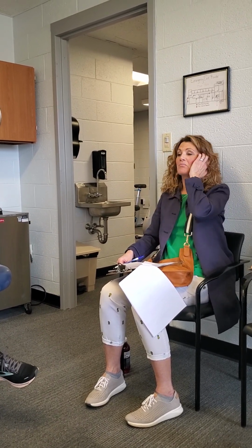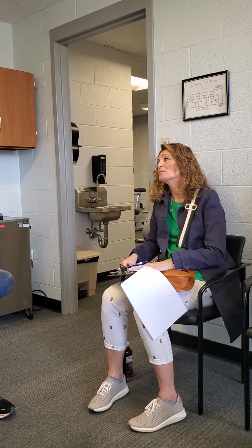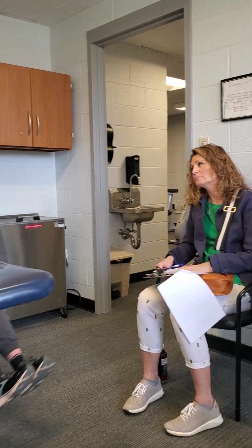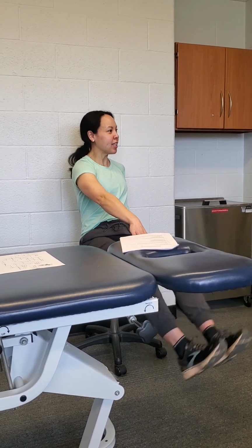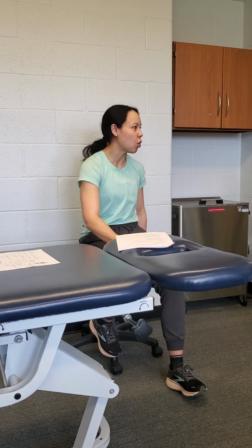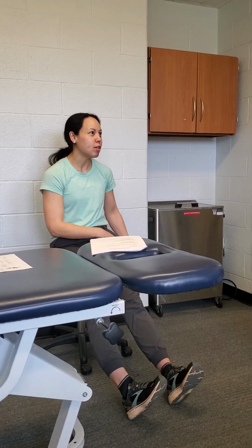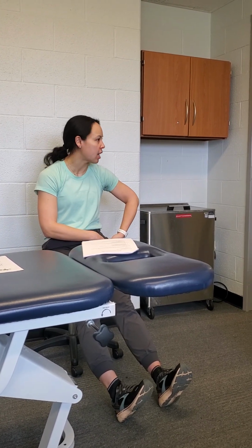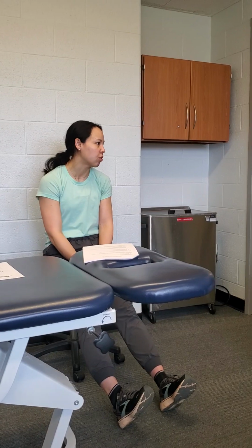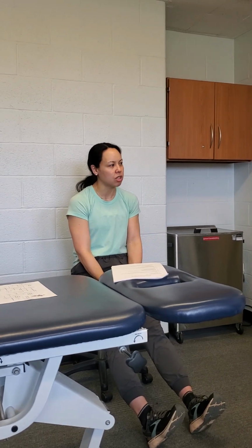Right, correct. So even if you're doing it on the side that's weaker, it will have a crossover effect on the other side. And in that study, they just did bilateral knee extensions 3 times a week for 4 weeks and showed gains. So if you had time, you can do both sides. But if your time is limited, I would probably do it on the weaker side and know that there's some crossover effect. And you're still working both sides with the exercise. So yeah, it is very interesting.